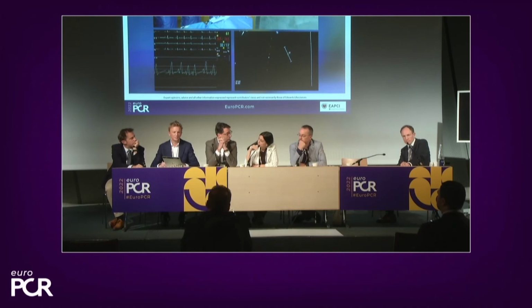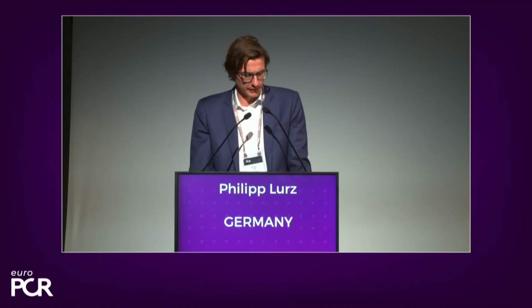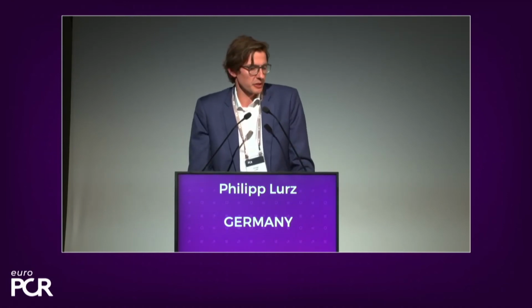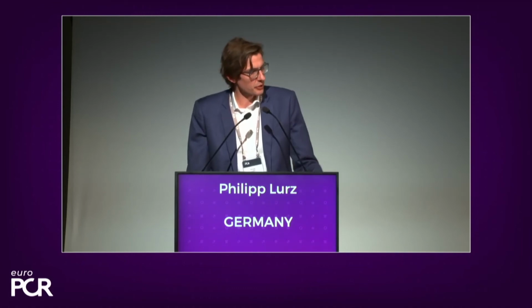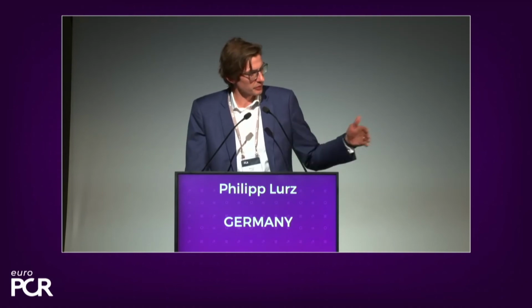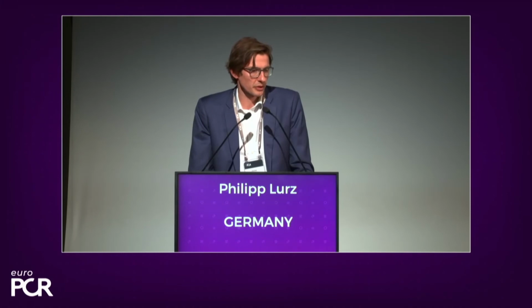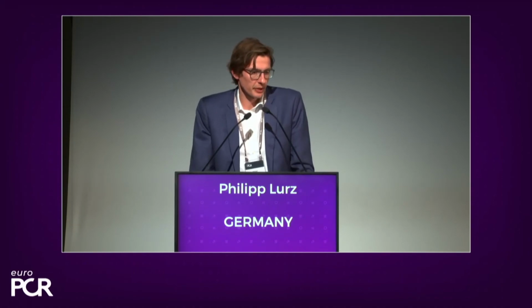I've noticed that you do all your grasping with a breath hold. Yes, systematically, almost always, unless it's really pretty straightforward. But in anything more complex, we like to do breath holds because obviously it gives you more stability, less motion. Normally, during ventilation, the device is moving from medial to lateral, and by having a breathing stop, you get rid of that motion, and the procedure is much easier, and you can be more precise with your steering and with the implantation.